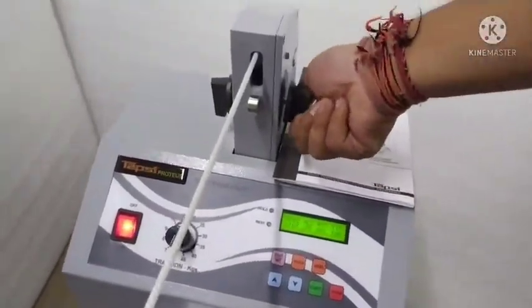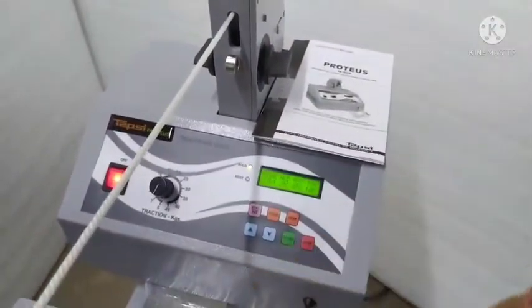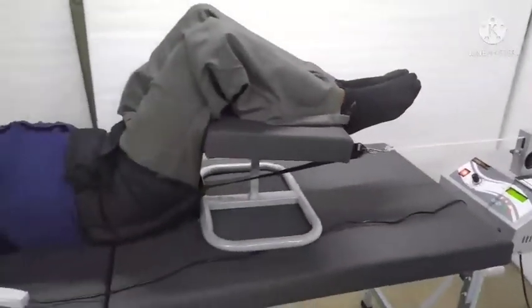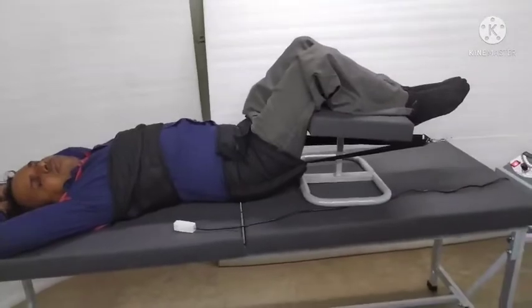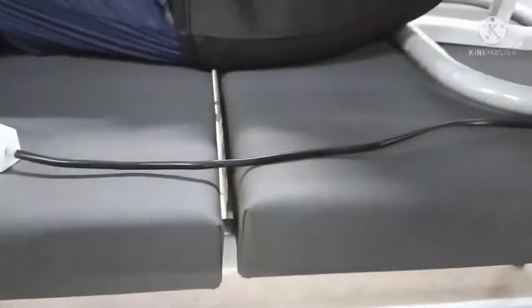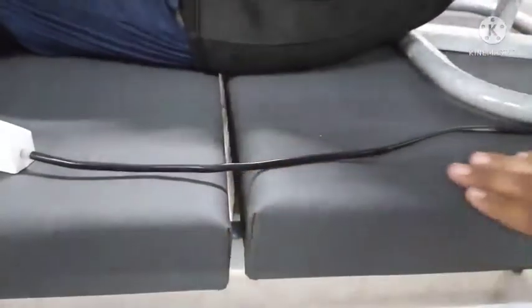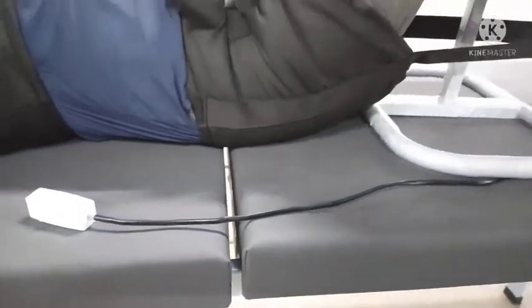Now we start the treatment. For that we have to set hold and start. Now treatment is started. And this is a lumbar traction position. The patient is in supine. Now you can see the table is moving when we start treatment.